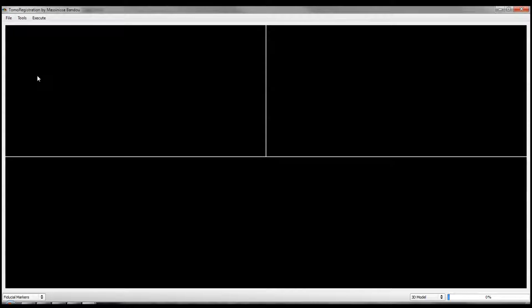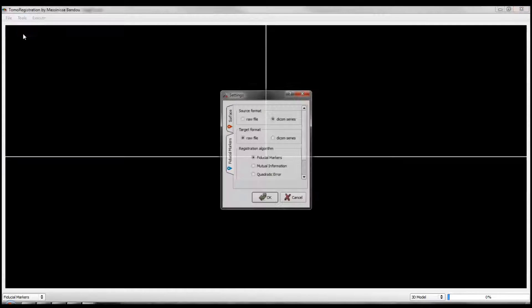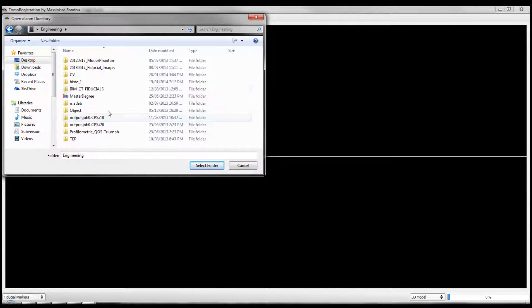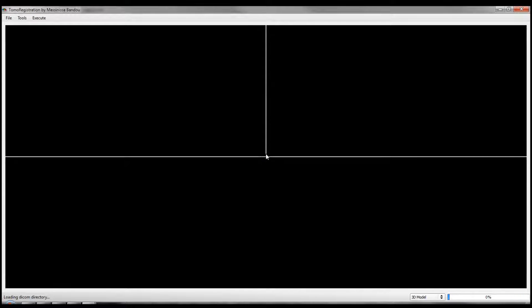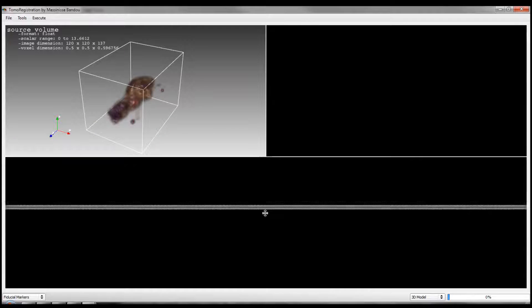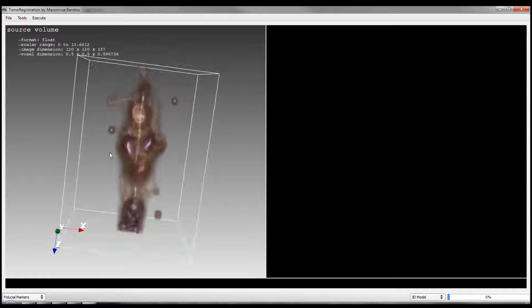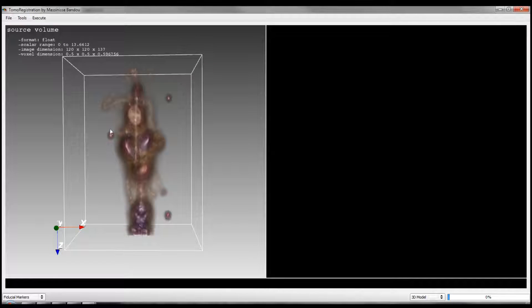Let's start with fiducial markers. This software can support three image formats: OBJ file for profilometric images, RAW file for CT/MRI images, and DICOM series for PET images. So we go to settings. The source is a PET generated from a DICOM series. The second is a CT from a RAW file. We load the source. As you can see, we have our image and three fiducial markers.